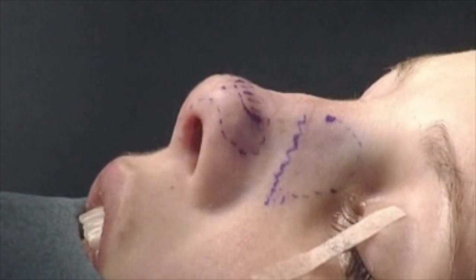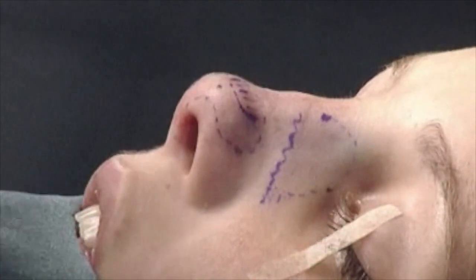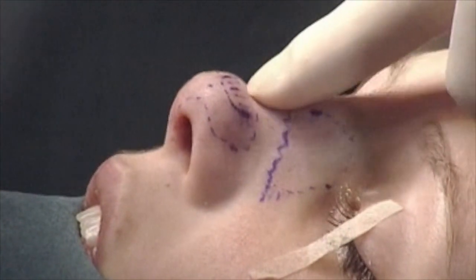Maybe I have some water. It's best to leave this to your assistant. Thank you. So, Rutger, you try it out.